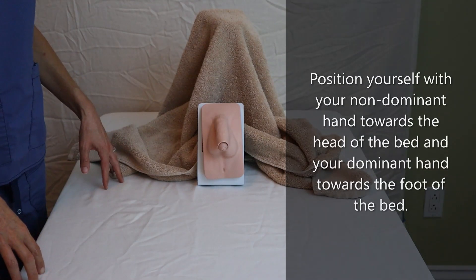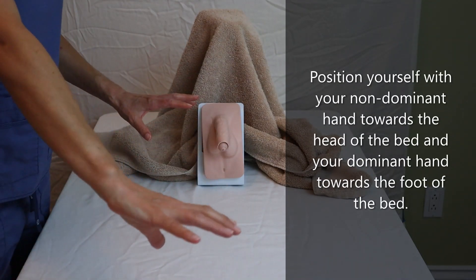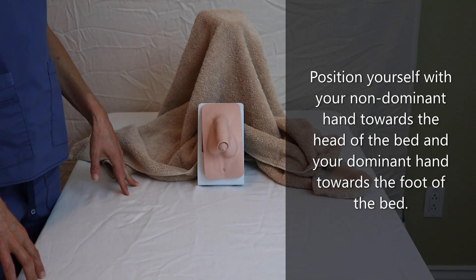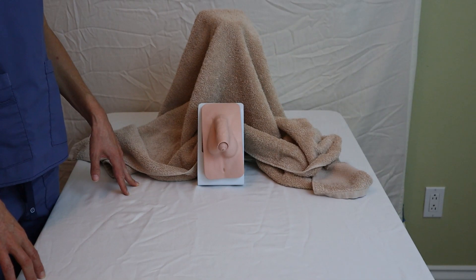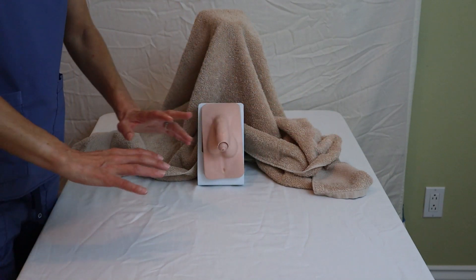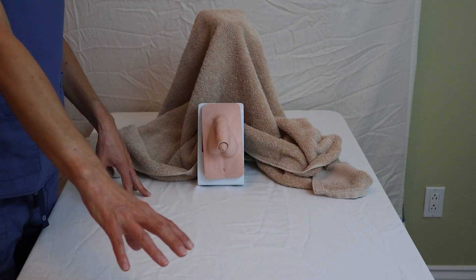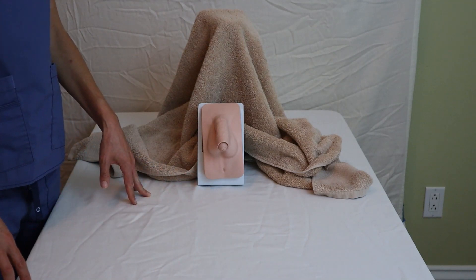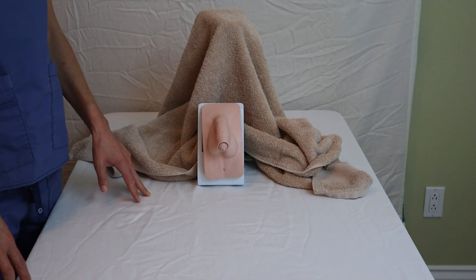I personally like to use the bed as my working surface. Some people might prefer to use an over-bed table and that is really up to you. If the patient is able to open up their legs and tolerate having the catheter kit in between their legs, this becomes my sterile working field. I prefer this because to me it's much easier to navigate the sterile field.